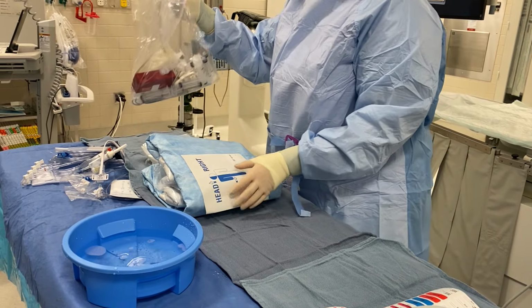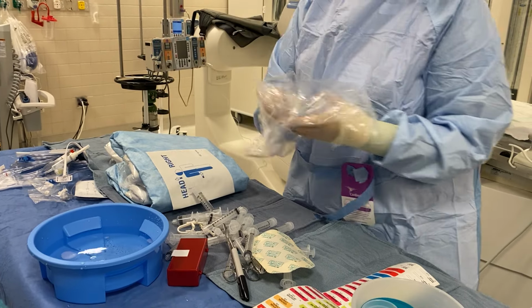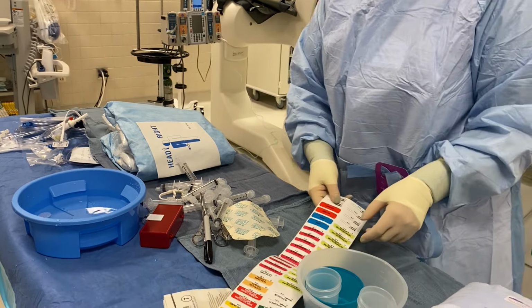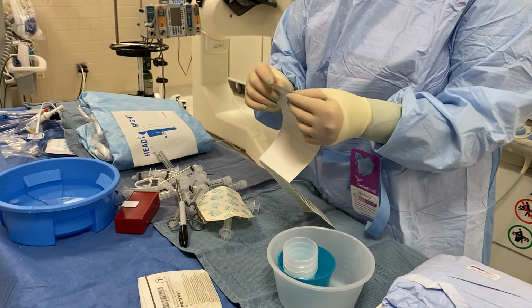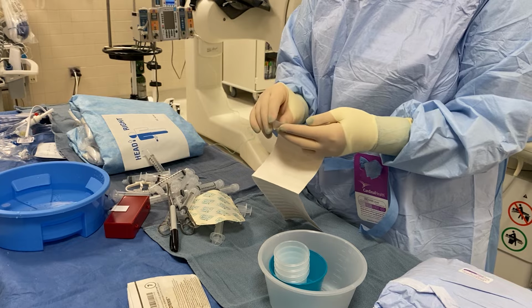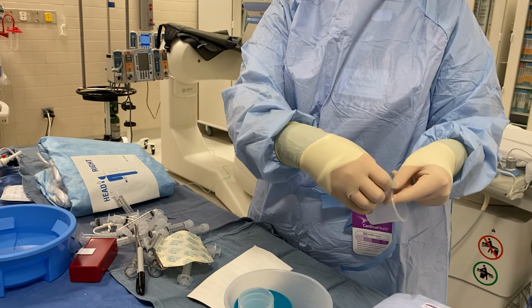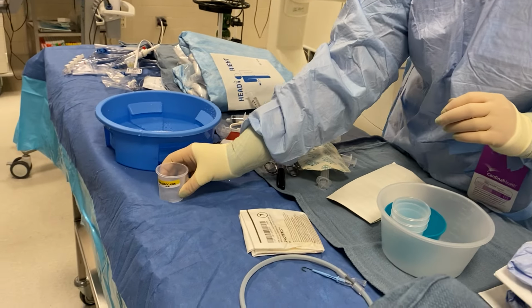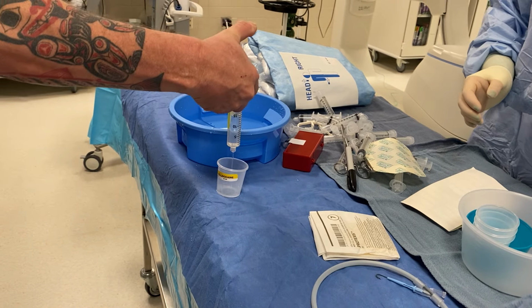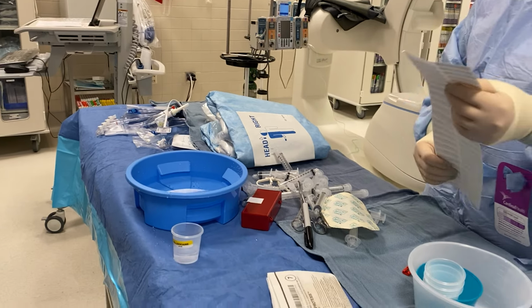The next thing that we're going to do, dump all of this stuff out. We also want to label our cups that we're going to need for any of our medications. So one medication for sure that we're going to need is lidocaine. So I have my 2% lidocaine sticker, and it's going to go right on the cup. And I'll lay it facing out so that whoever is giving me my medications can see clearly. Perfect. Very nice.